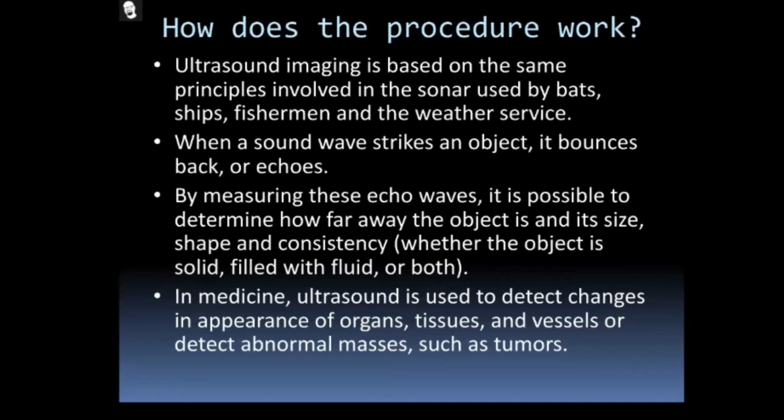This process is especially used for tumor diagnosis. If the patient is affected by cancer and you want to scan the tumor using ultrasound, this time duration is very important. How much time passes while you are applying the signal, and how much time passes while you are receiving the signal? According to the time duration, we can predict how far away the object is. That is what it is.